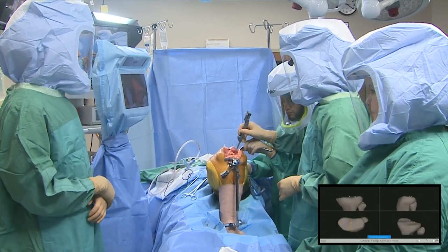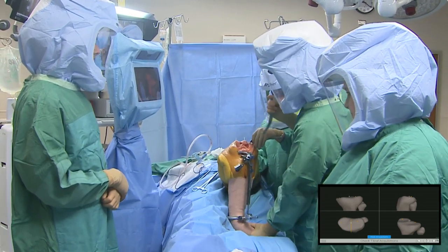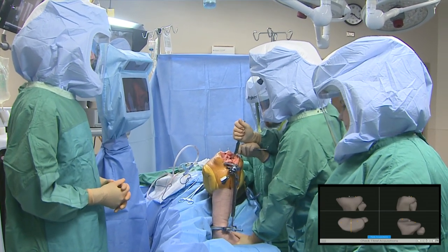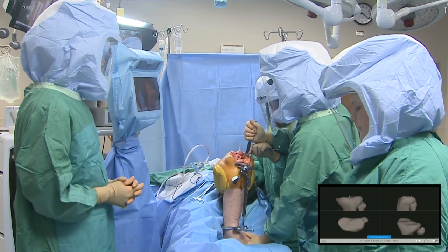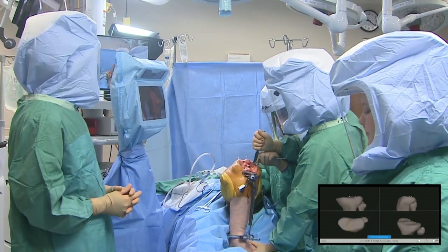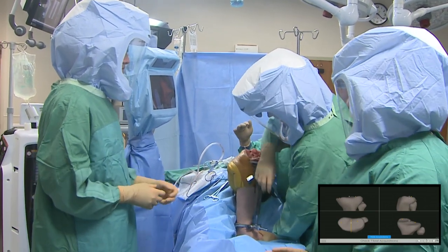There's a question about the advantage of avoiding the intramedullary canal on the femur while still instrumenting the canal and navigating. The answer is: baby steps. If you're not a navigator and you want to be a little better than how you normally are, initially you want to use instruments you're very familiar with — if you bail out, it's already there. They're developing guides that may place the femoral cutting guide without instrumenting the canal. Right now it's optimization of standard instrumentation.